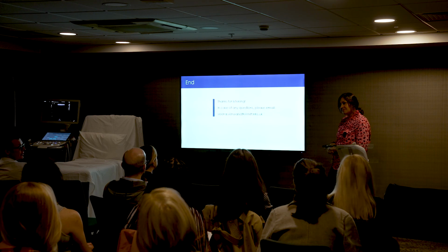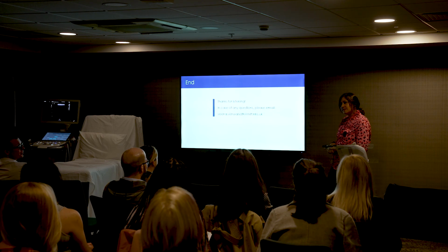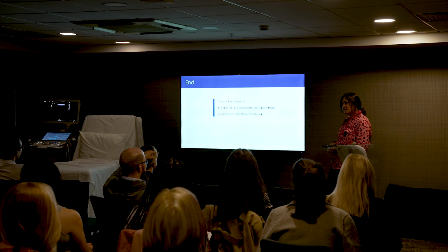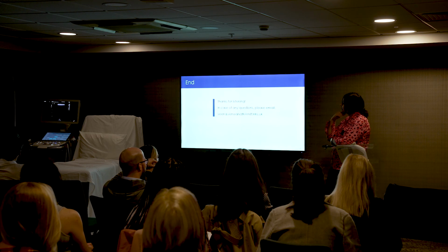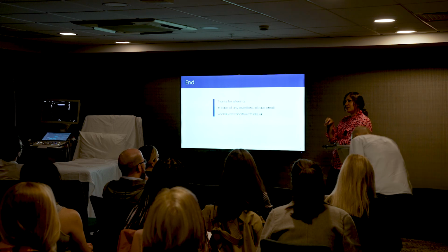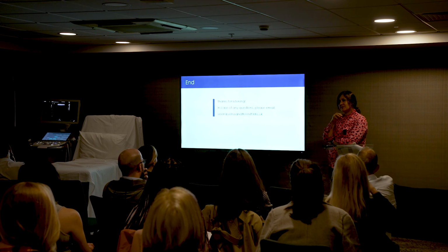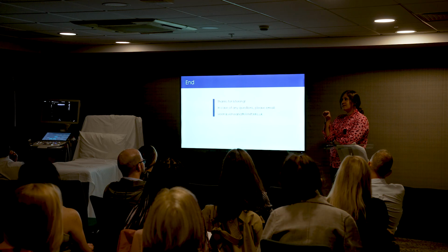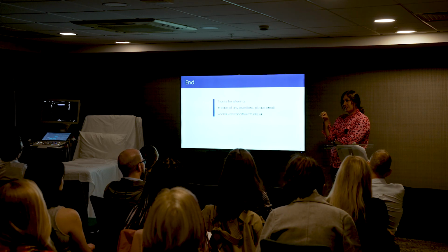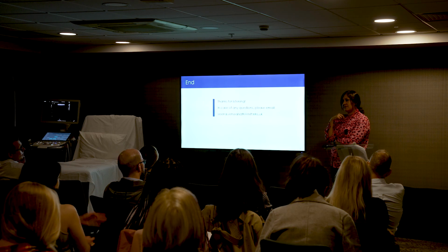For want of a better word, it's about bright speckly bits. So if you're differentiating between colloid and microcalcifications, the difference is just whether it's got a black tail or a white tail? I guess so, yeah. I guess with colloid, as Fiona mentioned, you just see this reverberation artifact going either side, in that it kind of just tails off in brightness and amplitude and thickness towards each end of that echogenic focus.